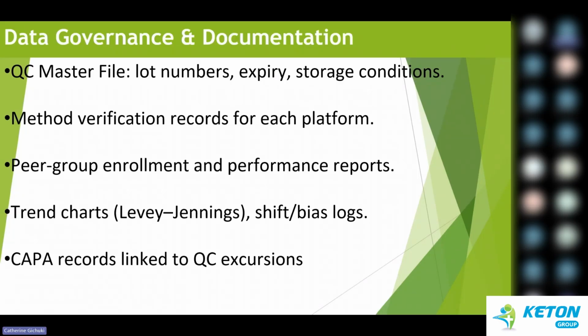Then you do method verification records for each platform. You will have to document that each QC material works correctly, even before any routine use. Then you will have peer group enrollment and performance reports. This usually allows us to keep reports showing how our QC compares with other labs using similar methods. You can do that even with EQAs or PTs, anything that can compare us with other labs using similar methods.